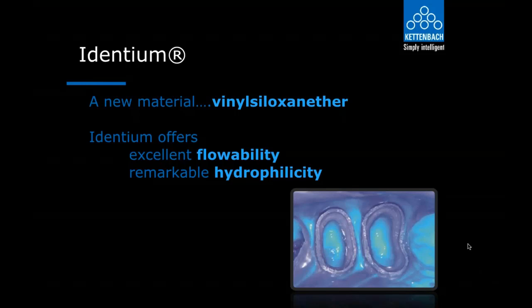Okay, so what's the difference? What's the advantage of polyvinyl or polyether? Well, now we have Identium, which is a combination of the two. Polyvinyl has to have good isolation. Polyvinyl is a great impression material, very accurate. It's been our mainstay for years. It's what we've used for years.